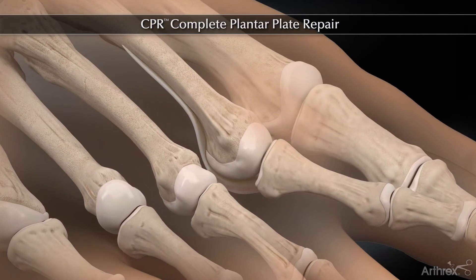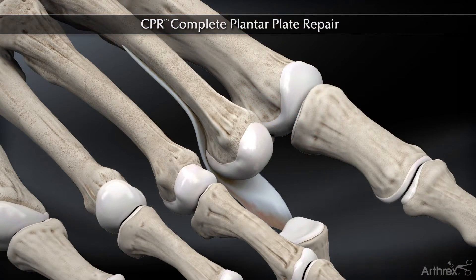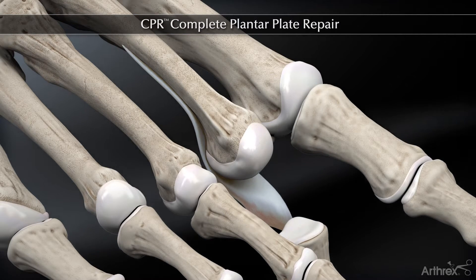The operative approach to a repair of the plantar plate starts with a dorsal longitudinal incision, either in the inter-space or directly over the MTP joint. We've plantar flexed the toe, and here we see a simulated tear on the lateral aspect of the plantar plate.